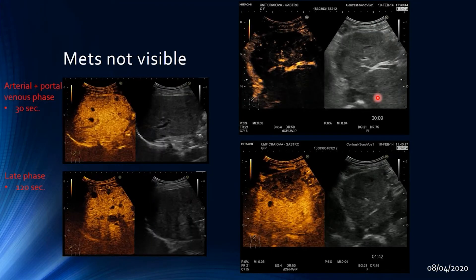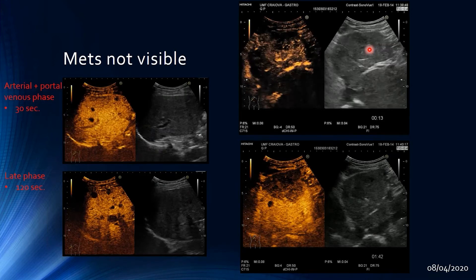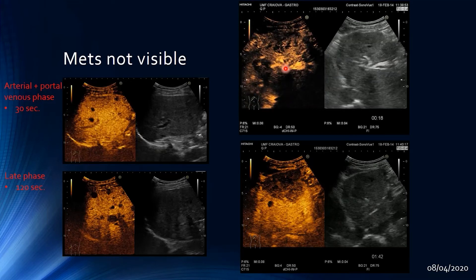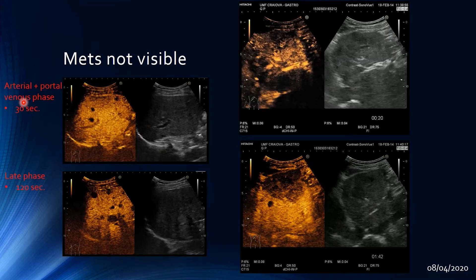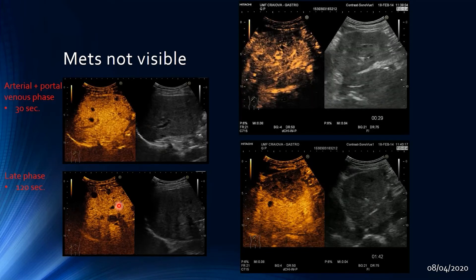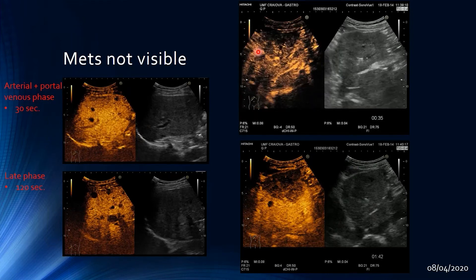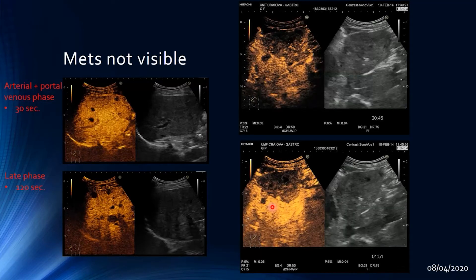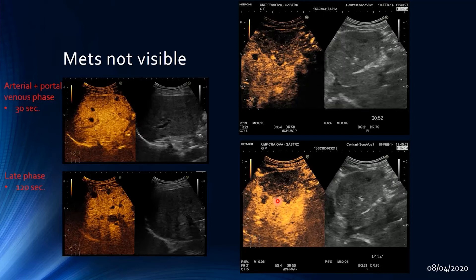Sometimes metastatic lesions are not visible on grayscale imaging. In such cases, waiting through the arterial and portal venous phases and then examining the late venous phase reveals multiple lesions with characteristic washout in the right liver lobe — a large lesion and several smaller metastatic lesions nearby. Contrast is therefore very useful even when lesions are not visible in grayscale mode.